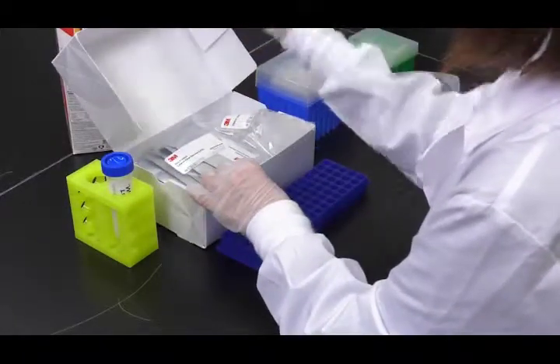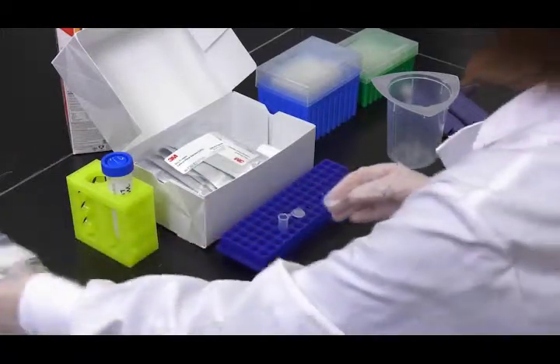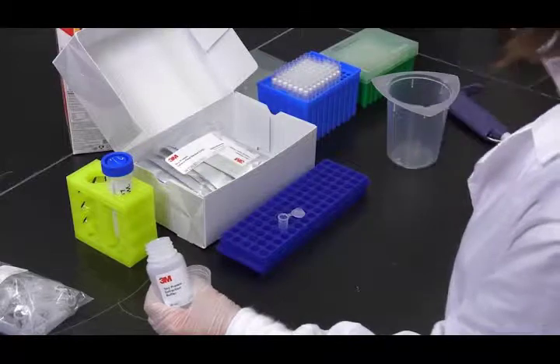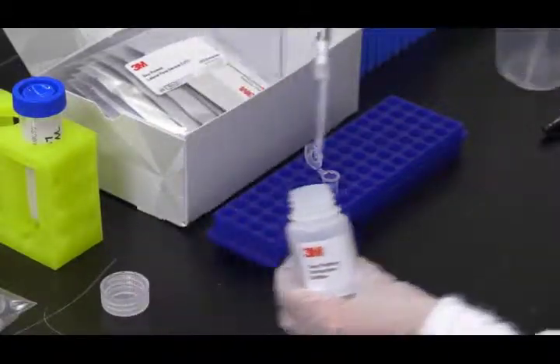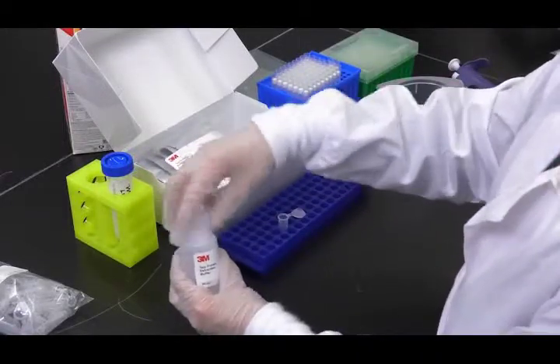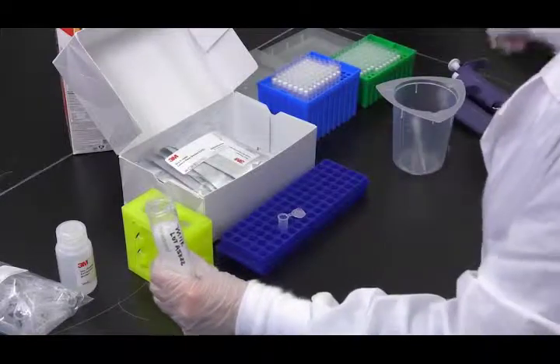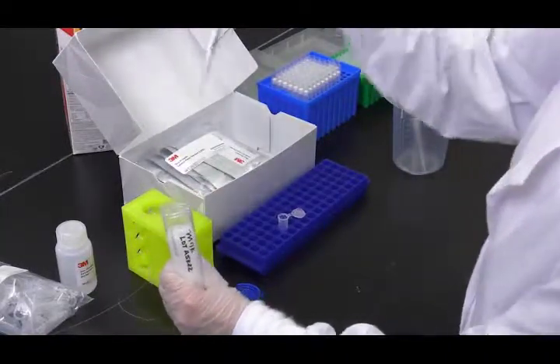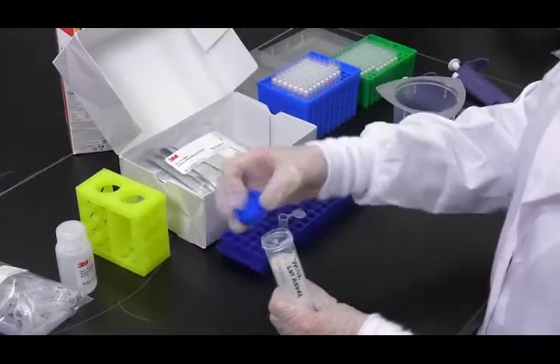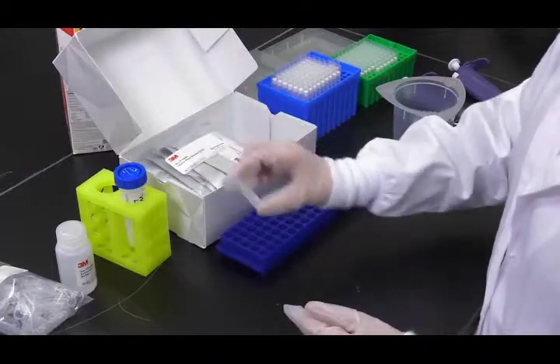To analyze liquid samples, first label one microcentrifuge tube for each sample. Then measure 900 microliters of 3M extraction buffer into the labeled microcentrifuge tube. Next, add 100 microliters of a well-mixed sample. Shake vigorously or vortex for 15 seconds to mix thoroughly.